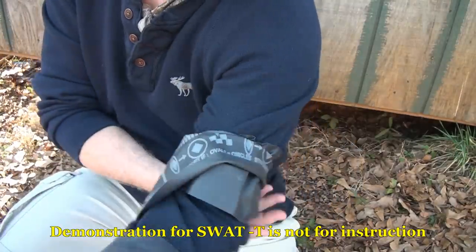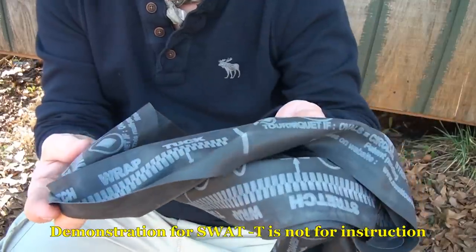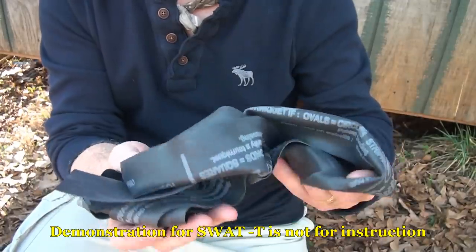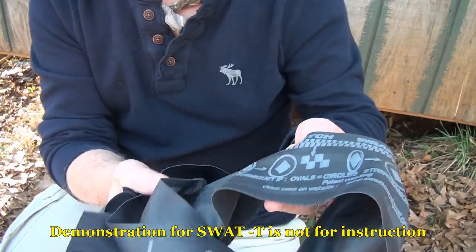I would highly suggest, too, that you go ahead and try out your gear. Of course, if you're using some of your gear, you can reuse this, but some of your gauze and stuff, of course, you can't. So you want to have extra on hand. But really, practice is really important. And what's even better is to get really professional instruction with a medical professional. And these are safe for about 2 hours. So go ahead and get medical attention as soon as possible.